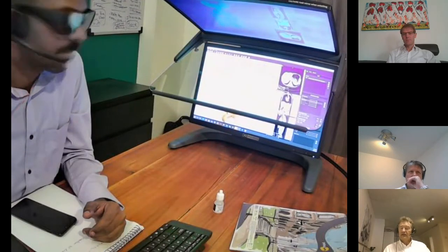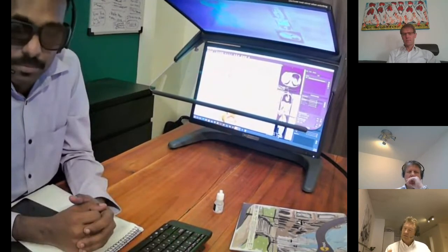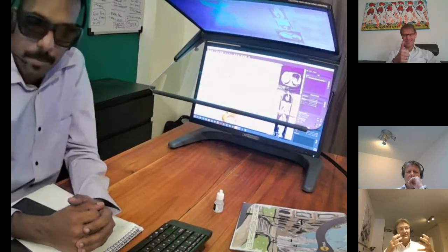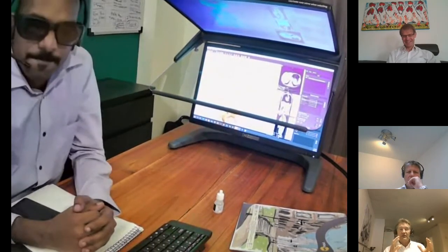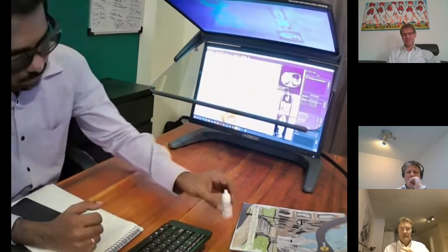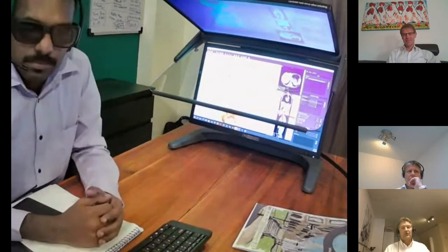He looked at the 3D print, and then he looked at the screen. And his remarks were, oh, but actually, I can see it even better on the screen now because I see the whole surroundings. I see the whole structural information. I don't only see the problem area, but I also see how to get there and how to start working on it.